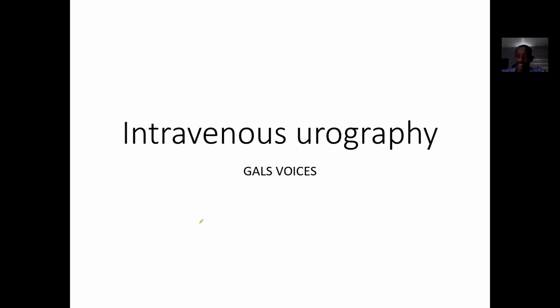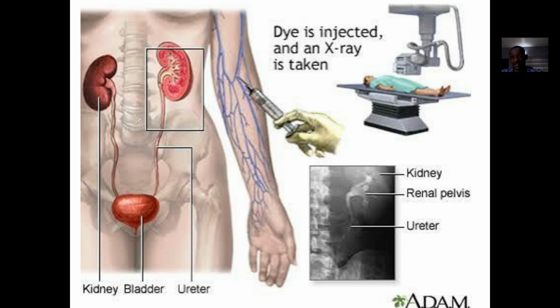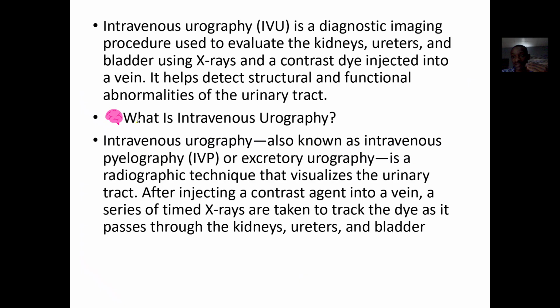Now we'll talk about another imaging modality, and this is what is called an intravenous urography. If I'm challenged with a word like this, I try to define the terminologies. Intra is inside, venous is inside the vein. Urography: urine, you are dealing with what? The urinary system. So from there at least I'll have an idea.